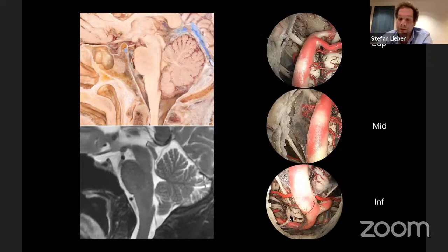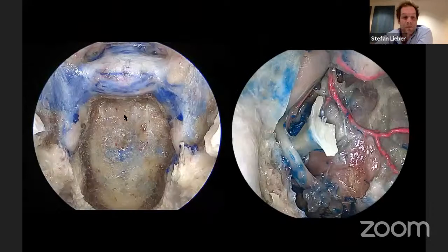And inferiorly, you see 12 traveling inferiorly towards the condyle, mixed nerves in the back, and PICA branches of the vertebral artery in the view inferiorly in the midline. Just a bit of detail for the mid-clivus.